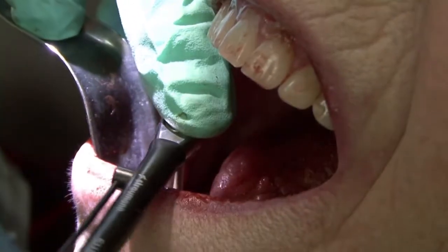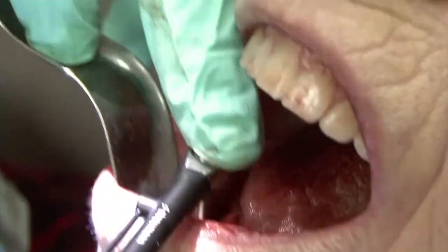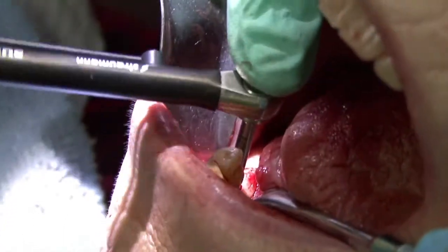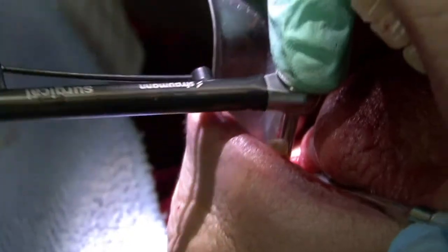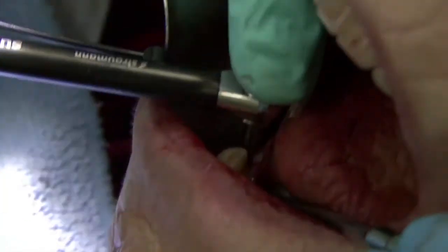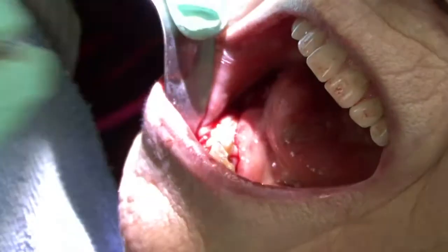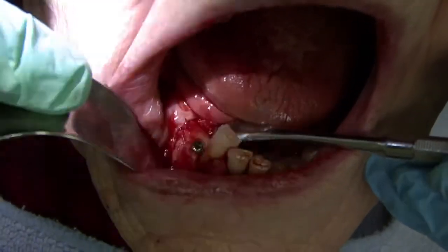The amount of primary retention we have now is amazing. We're already up to 50 Newton centimeters of force. So if you can zero in here, we're about 55 Newton centimeters of force to fully seat it. The primary retention here is amazing. Let's take this. And you can see it's down.